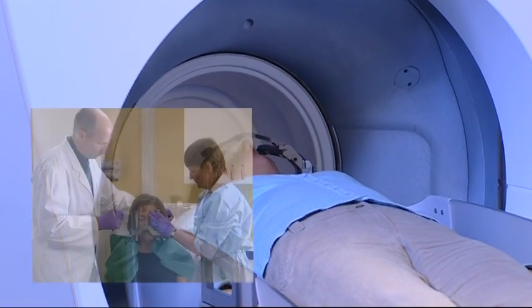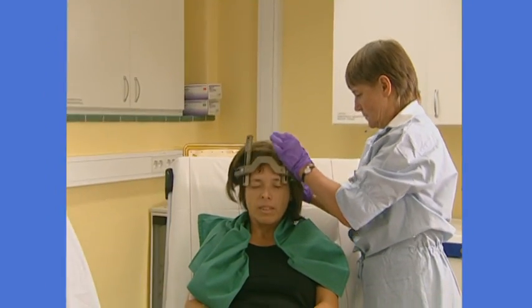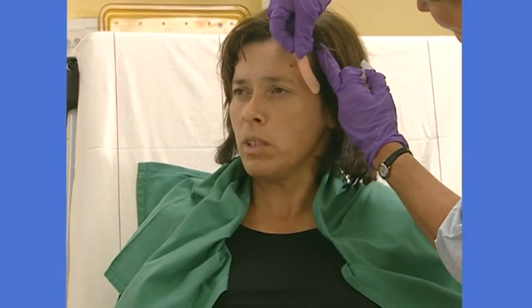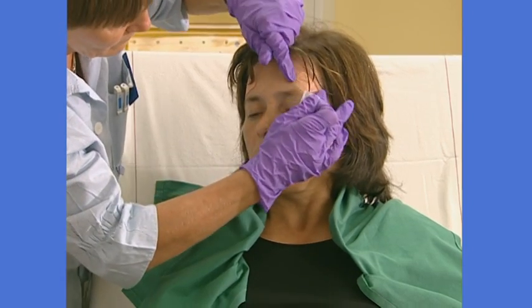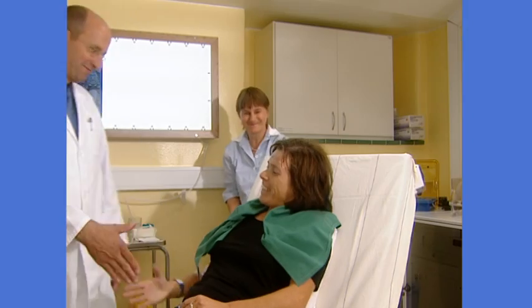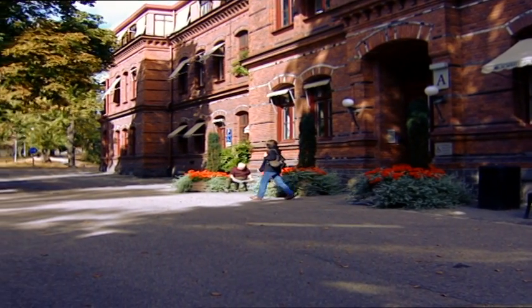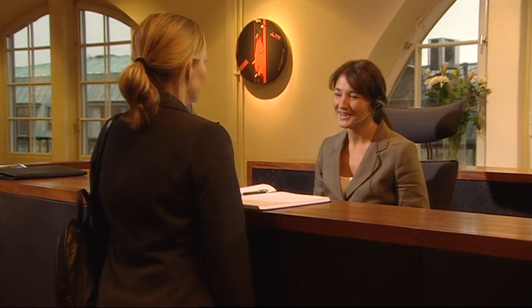Once treatment is complete, the frame will be removed. Some patients may experience a mild headache or minor swelling where the frame was attached, but most report no problems. The doctor will inform you whether or not an overnight stay is needed for observation, or if you can go home immediately. Either way, a patient should be able to return to a normal routine in a day or so. The doctor will stay in contact with you for periodic follow-ups and consultations.